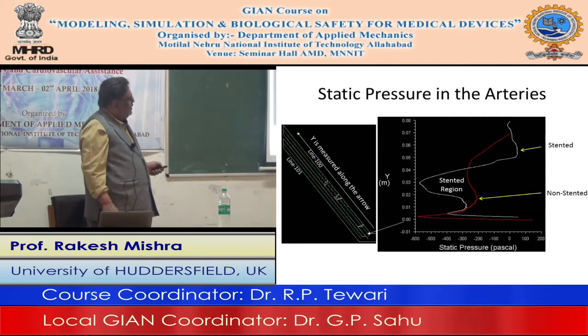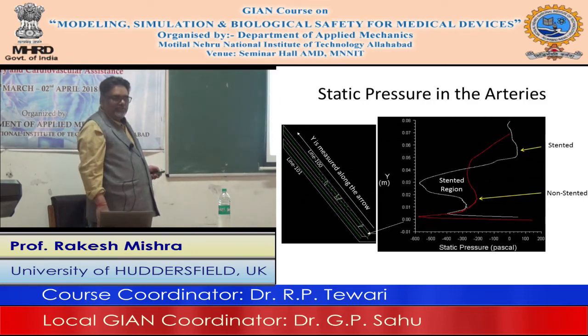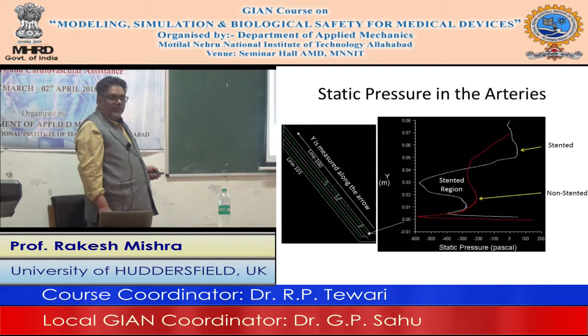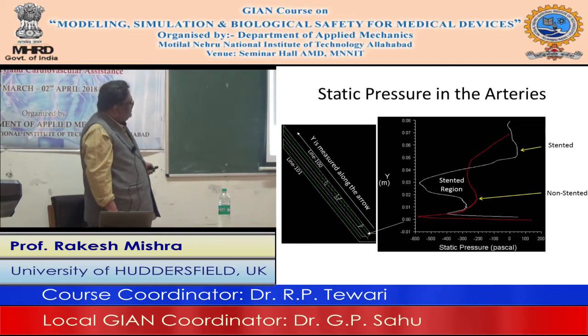Now you can see, if you look at this picture, there is not much difference, is there? They are different, but you can't quantify it. But now when you look at this picture here, drastically different, aren't they? And that is what you wish to highlight. That is why CFD is being done. You can see in the stented artery, and it may not be only the stent effect, it may be the geometric effect as well, the complexity. So you can see in the stented artery, pressure is varying quite drastically.